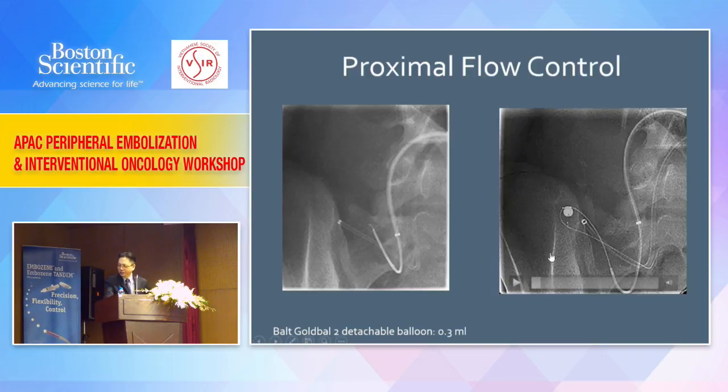Well, the patient came in, and this is the second session of angiogram. One way or another, we have to ensure no recurrence. These are cases where we can be very sure that the patient will not come back if you do the appropriate thing. This balloon will deflate by itself in a month or 6 weeks. And this is a 7 mm hole fistula. The moment you start to deflate, the blood flow will return, then you get a recurrence. So by hook or by crook, you must close this off. You cannot take the risk of deflation and recurrence.